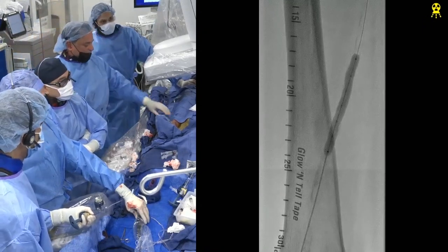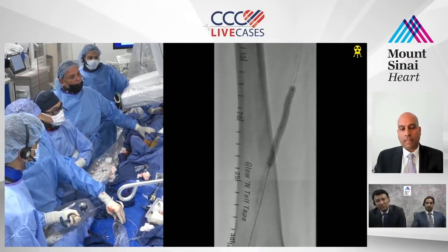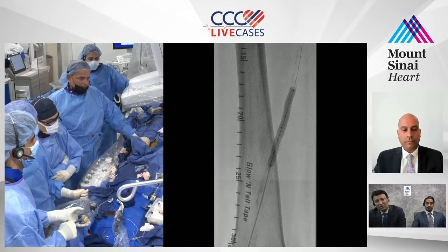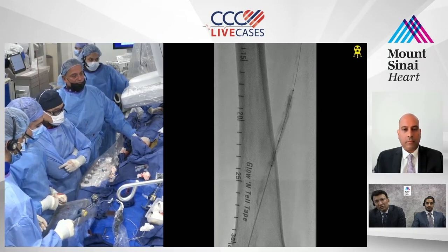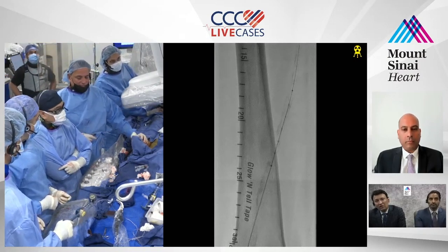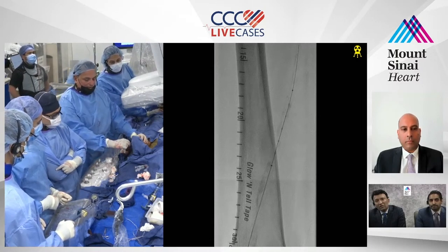The patient is having pain. Are you going to exchange it to a steel core wire, to get more stiffness? We might. Okay, all right, let's walk. I think we should walk this out, go with another catheter, then change the wire, and then try with a new balloon. She's having pain when I push, so we're going to leave the wire as is, and I'm just going to track the shockwave out.